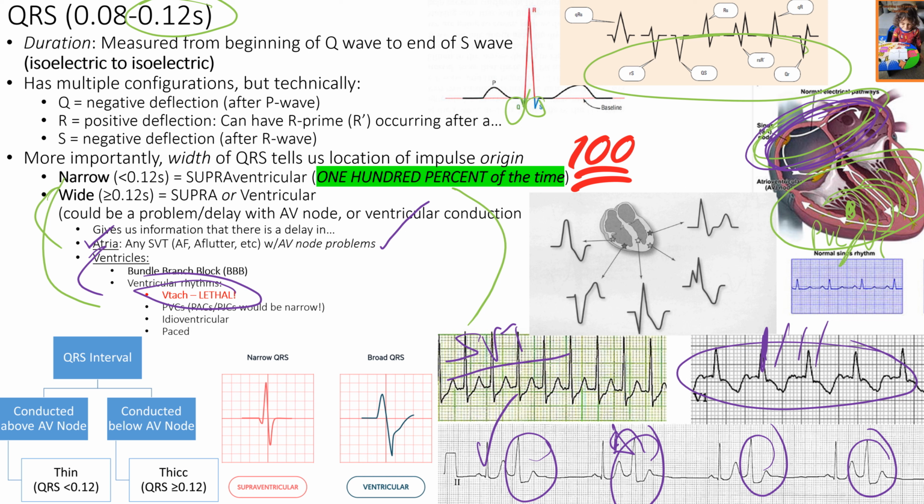That requires expert consultation. That means you notify a provider so they can look at it and look at the patient too, see how they're looking, and they might require medication, right? If that is indeed coming from the ventricles, which is probably not because there's P waves before the QRS complex, then if it was like a ventricular tachycardia, we can give medication for it, right?